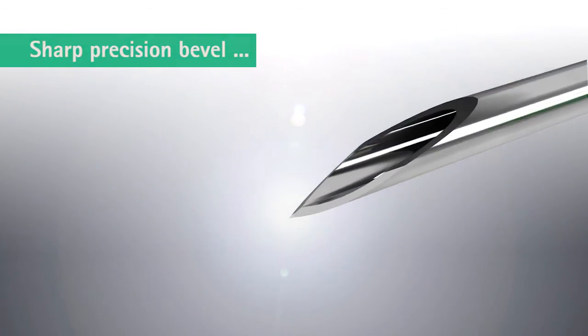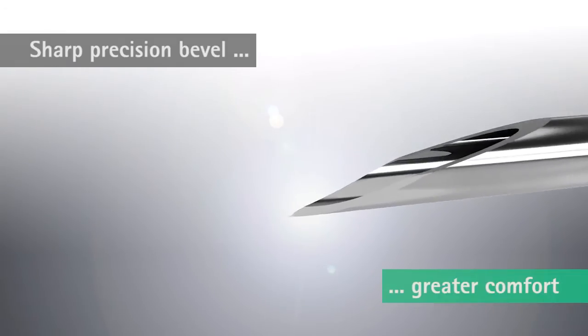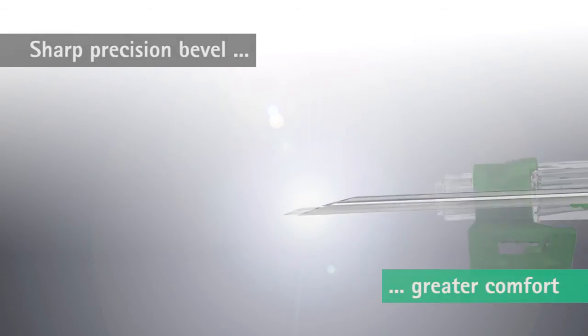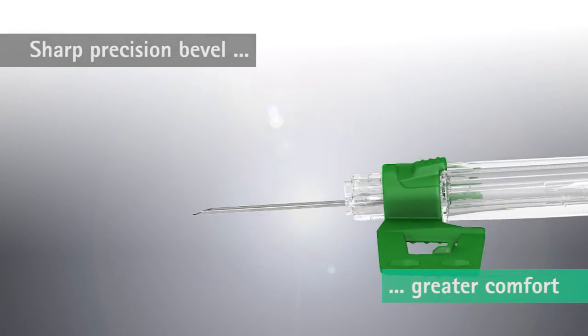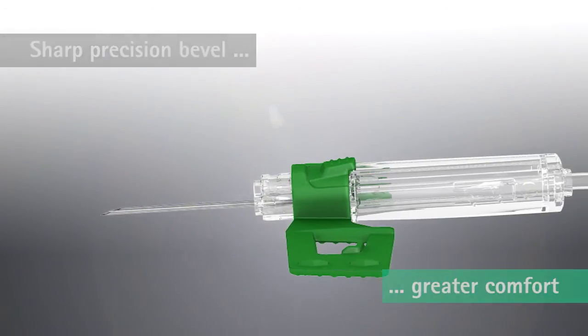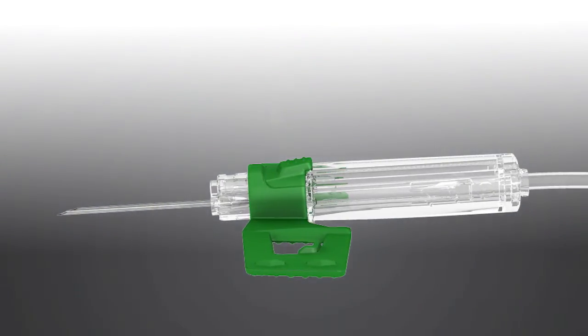The sharp precision bevel on the VinoFix Safety winged IV needle is micro-siliconized to allow an easy, smooth needle insertion, resulting in greater comfort for both the patient and the clinician.